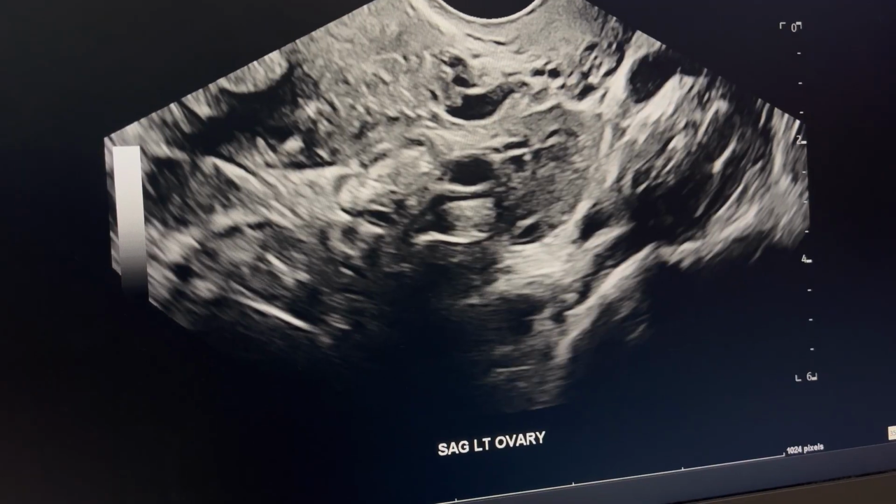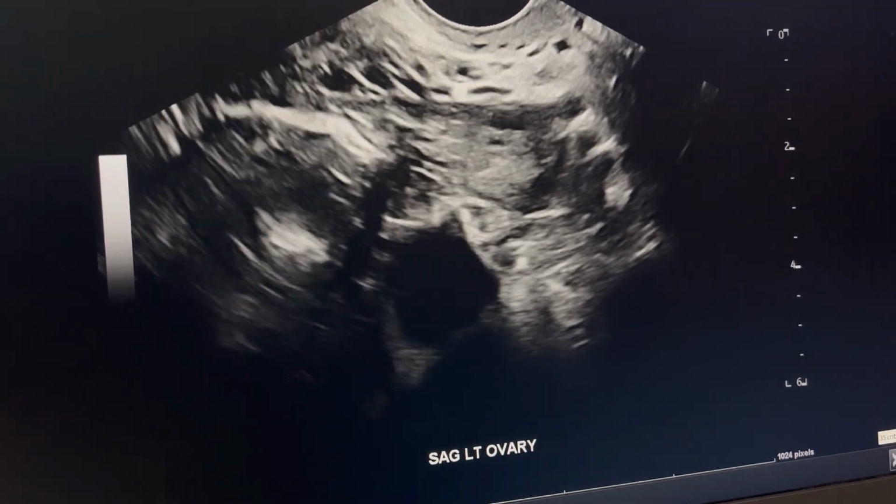Long day, but very, very productive feeling. I went to work, woke up early. It was a lot of patients that had pregnancies. I did about 12 patients today, a couple of pediatric patients and some adult patients, but a majority of the adults I did were vaginal exams, so that was crazy. Everyone was pregnant. Everyone had complex cysts in their ovaries, so yeah, it was a lot.